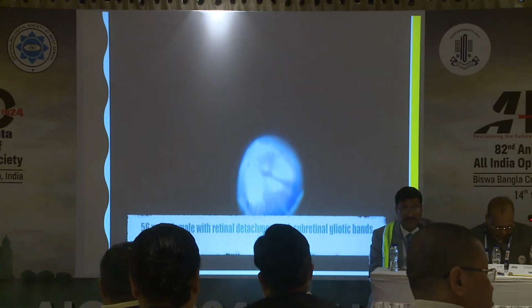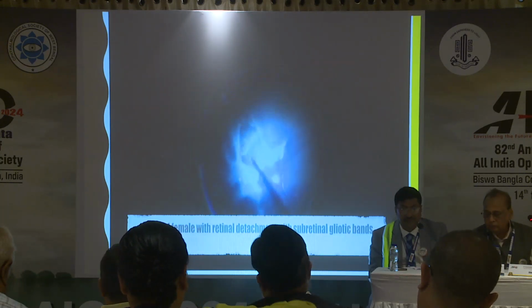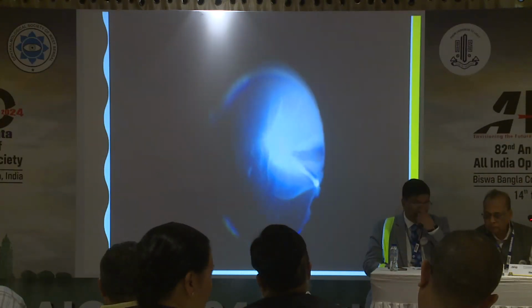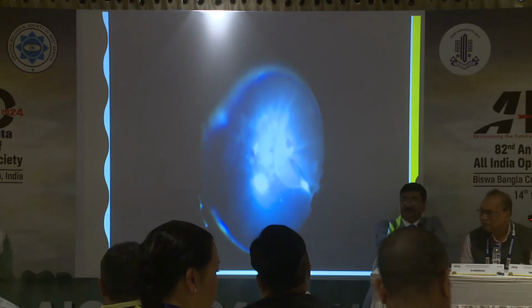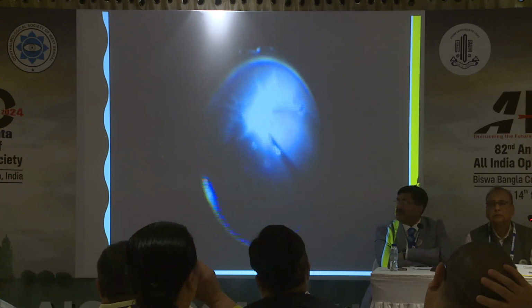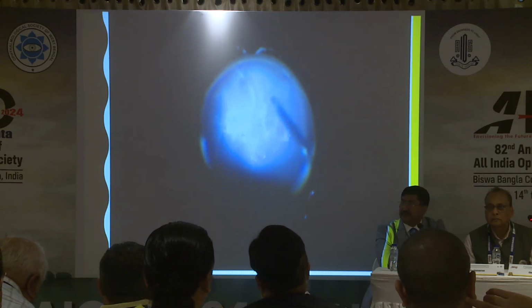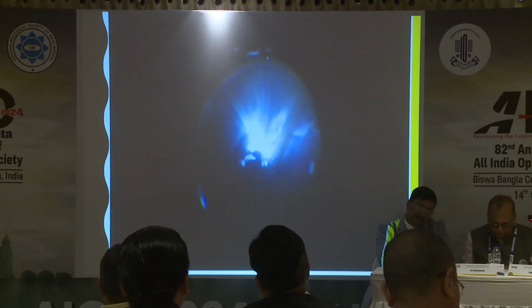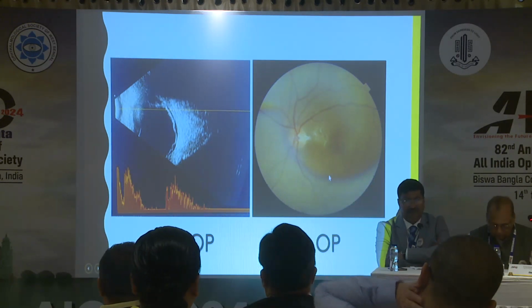Case 3. Here we had traction below the retina. There are multiple subretinal gliotic bands. Initial staining with triamcinolone was done. Clearing the vitreous in all the sectors was done. Now the bands are not allowing the retina to settle. So multiple retinotomies were done to remove the bands in the different quadrants, because the bands were touching each other in a circumferential manner, like a napkin ring, and not allowing the retina to settle down. This is the pre-op picture in a B scan, and this is the post-op picture. You can see a well settled retina.